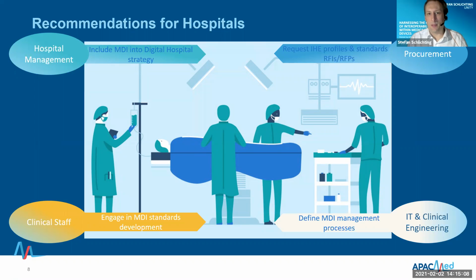So on the one side, the hospitals are, of course, those stakeholders that later on use and buy the products that might integrate medical device interoperability technologies. So on the one hand, I think what is very important is if the hospital has a strategy for becoming a digital hospital, they should include medical device interoperability as one of the key technologies or enablers for having a successful implementation of such a strategy.